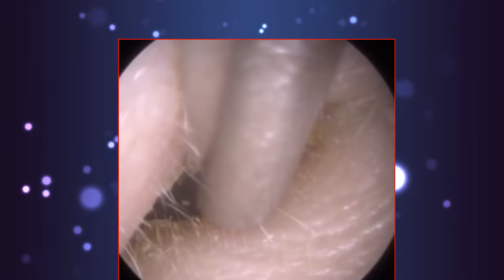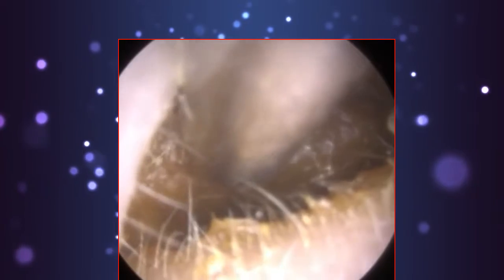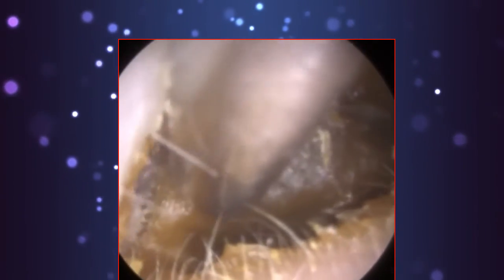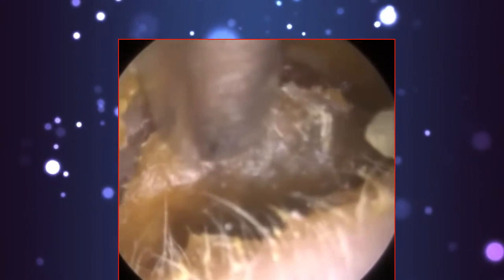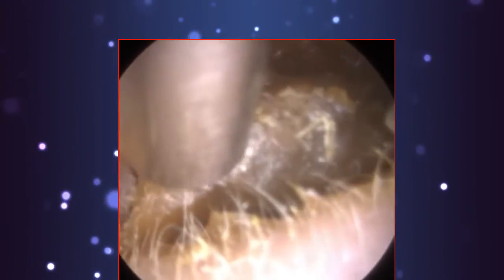Monitoring camera, we've got the capability of airdropping procedures to patients. Now, their main complaint was that they experienced severe itchiness and irritation in their ears. The patient has got very narrow ear canals, and they suffer from a condition called otitis externa.